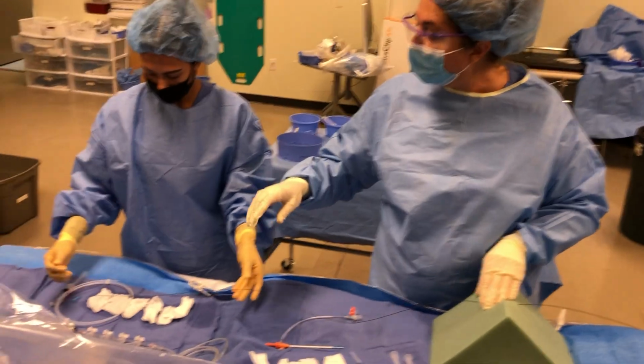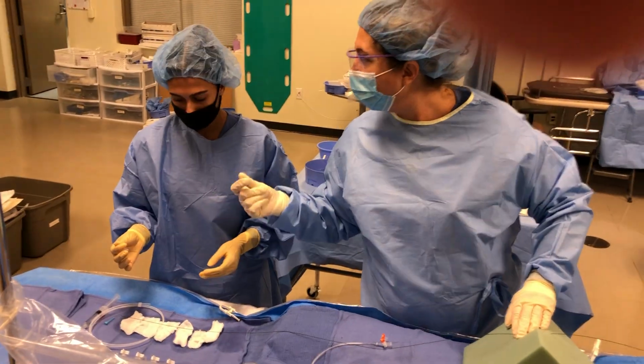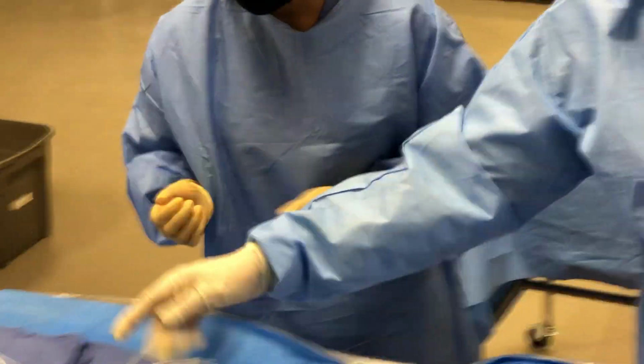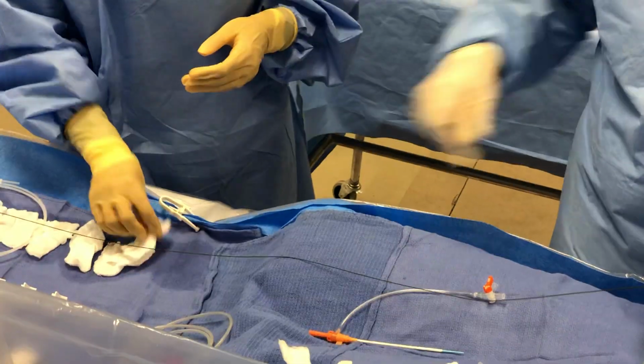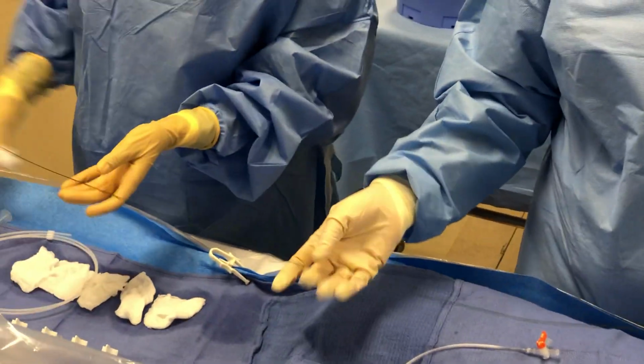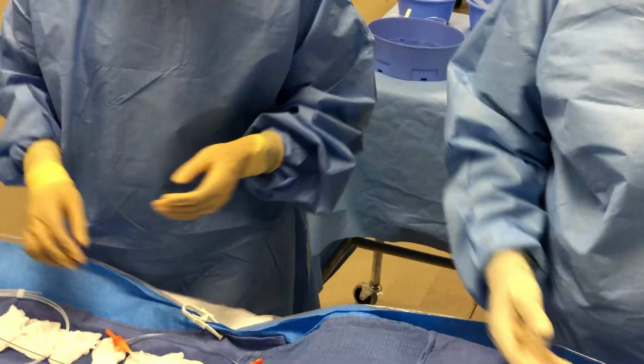So you wanna make sure that you just don't get close to the sharp part. Pull your needle off. Now, if one of these doctors don't wanna wait, you can lay your needle down over there away from you. Go ahead and wipe. Come all the way here, because there's blood on that wire, wipe. And then you're gonna load the sheath on.